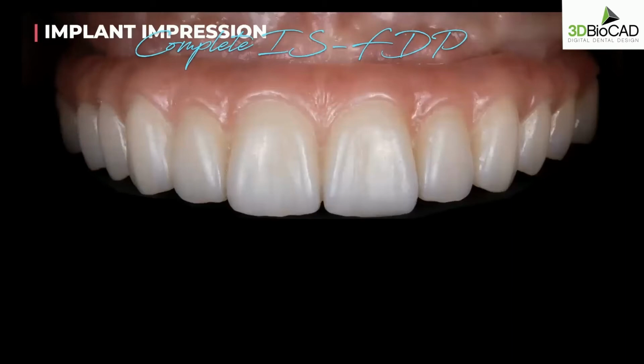So as you can see, I wish I had more time to show you the traditional workflow and compare the digital workflow, the scanning protocol, to the traditional impression protocol. Because the digital protocol is much, much easier, and it's just as accurate, if not more accurate, and we're able to transfer the soft tissue contour really, really well to the lab.